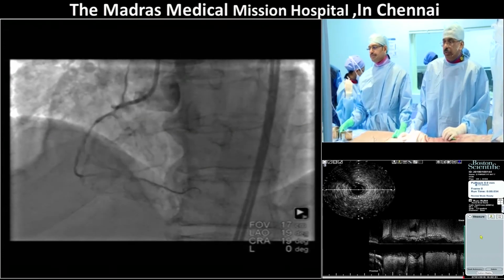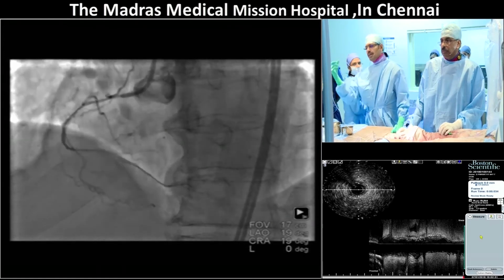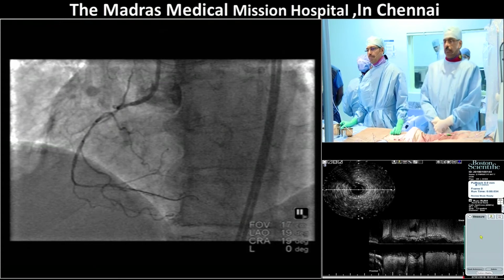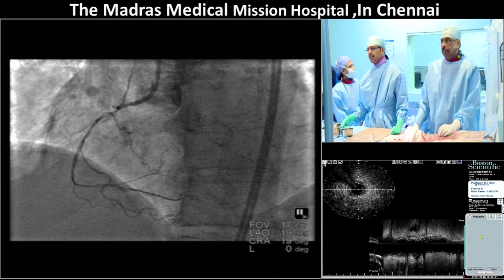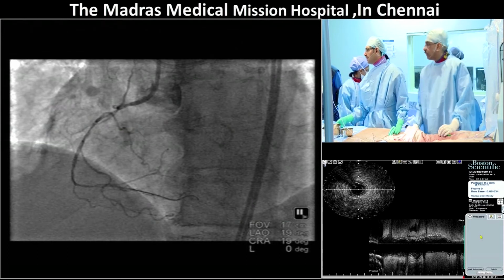What would others do, audience? Would you differ? Would you try to chase that dissected distal RCA and try to fix it? Then we take a long... any opinion from audience? Because the distal vessel is a small vessel, diseased. Stenting is not a great option for that. If at all, you can do a prolonged balloon dilatation if you get into the true lumen. Instead of that, I think you can just leave it, because many a times they heal.